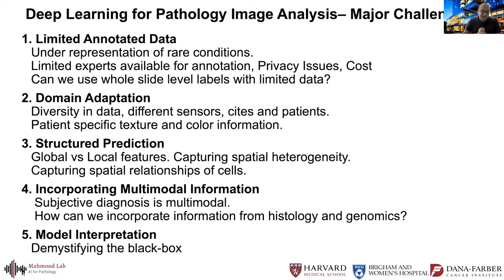Structured prediction: a lot of the deep learning methods that are fashionable and in use today are not very context aware. And then incorporating information from multimodal sources, multimodal information incorporation, is an open problem that has been studied extensively. And then model interpretation, and how we can start demystifying the black box while addressing these large scale problems.